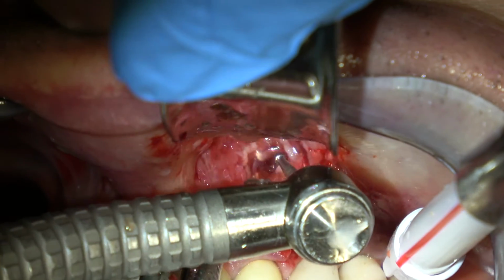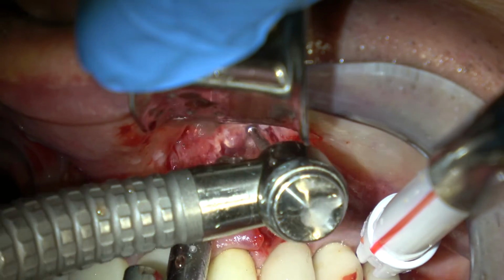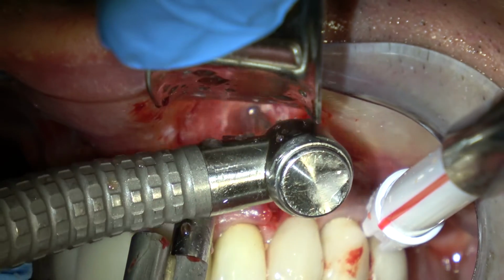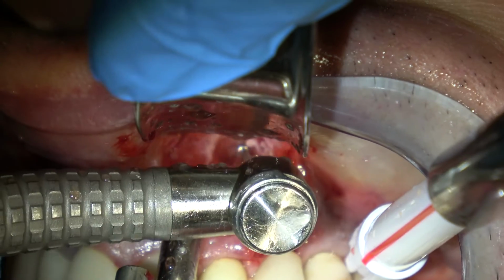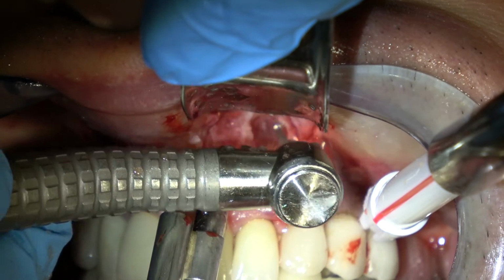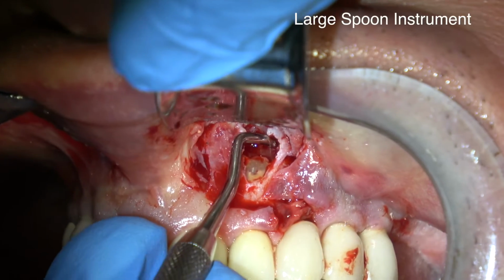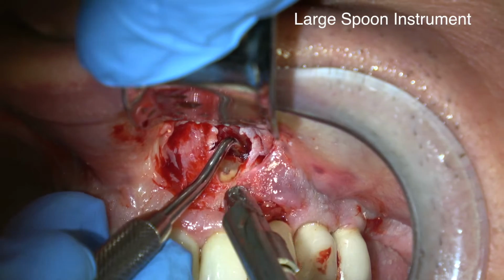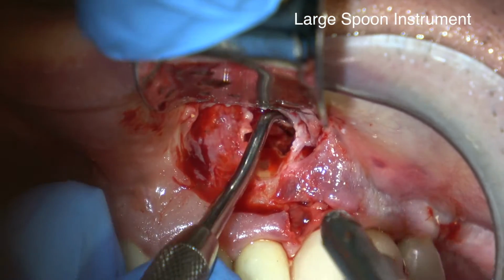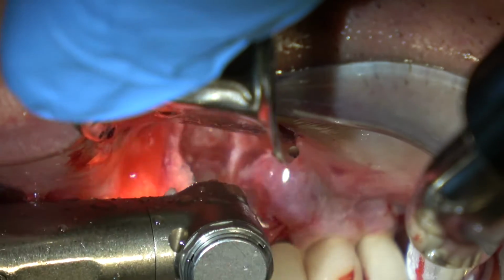Okay, so again, with this high-speed number 4 long-shank round burr, I'm just going in and barely touching the bone, not much at all, but I'm just removing all the crud, all the granulation tissue from that defect before I come back with my spoon and really curette it. This is just a large spoon, and you can see there's still a little lip on the tip of the root. So I'm going to come back here in a minute and cut that off so I can ensure that I'm getting all of the granulation tissue out of the defect.